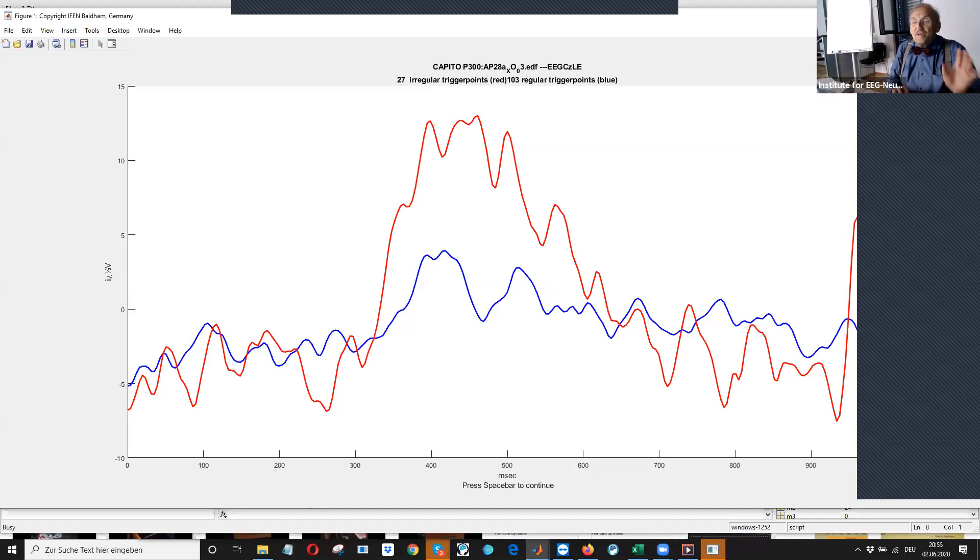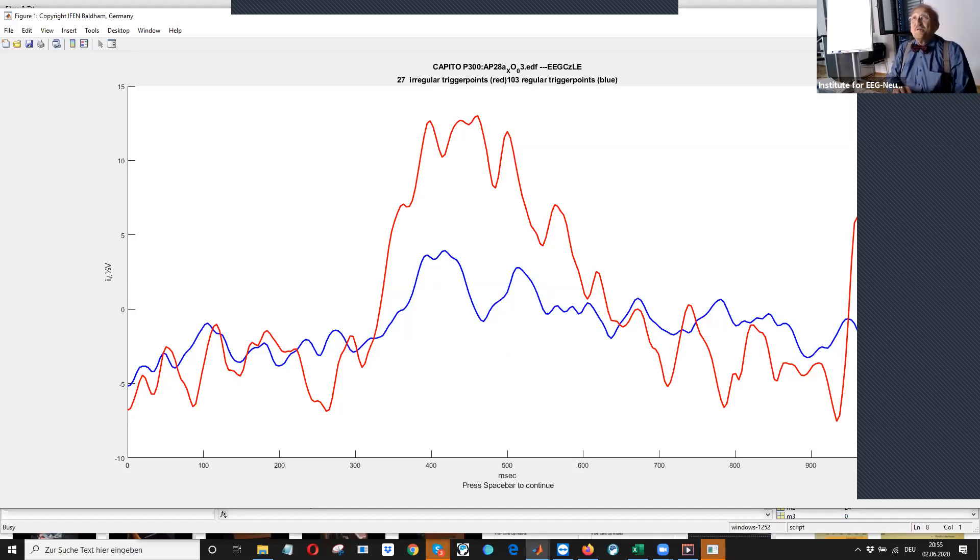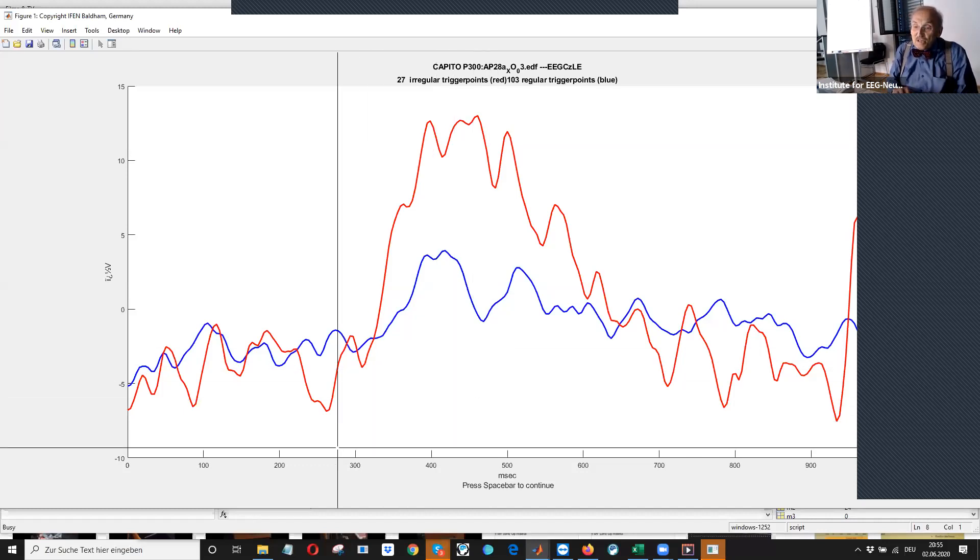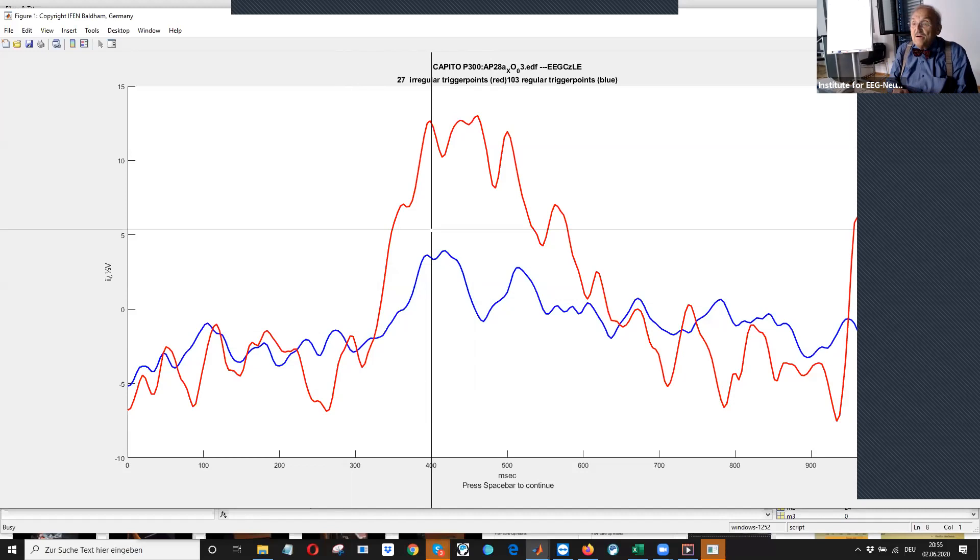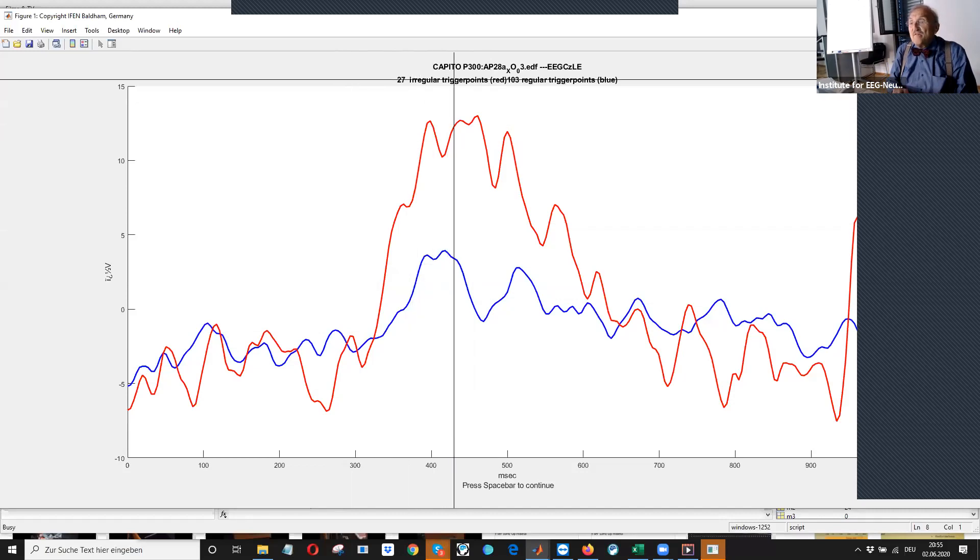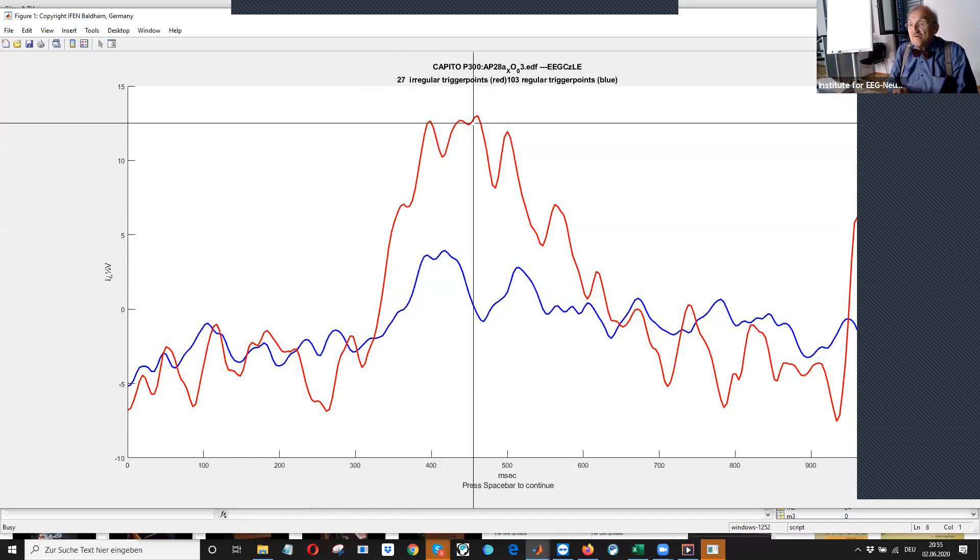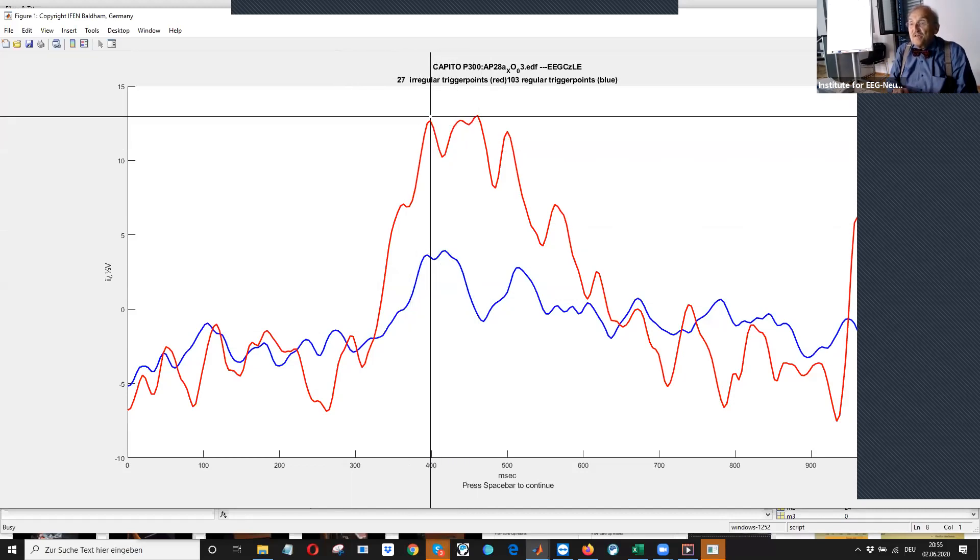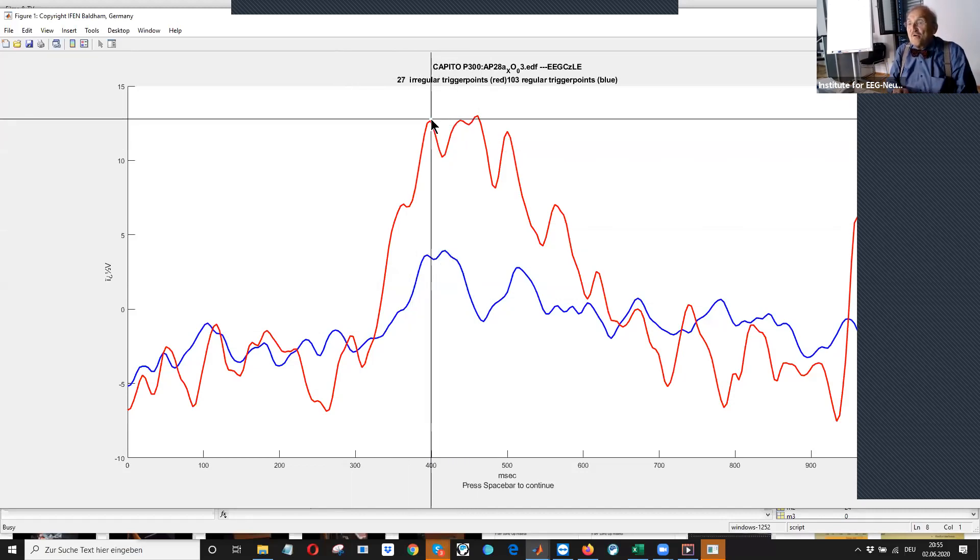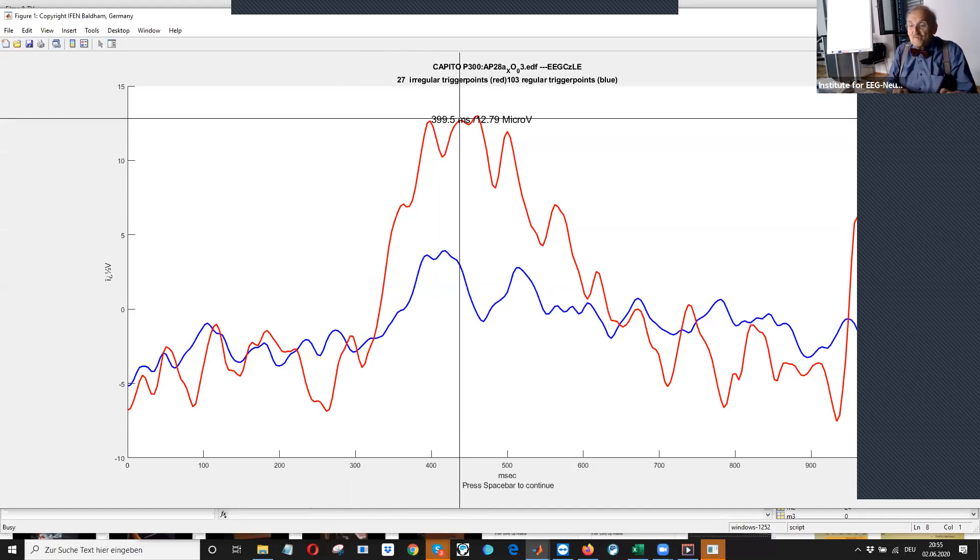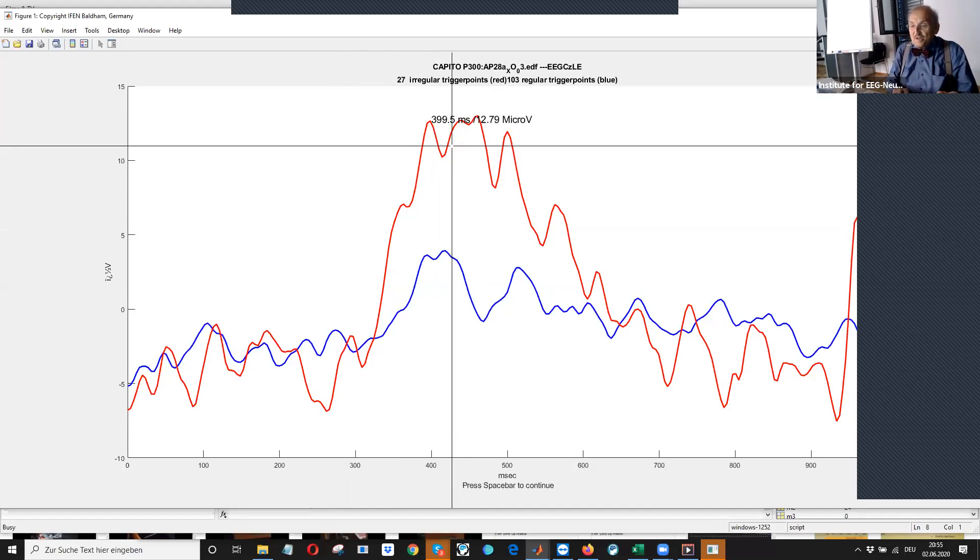If somebody has tried to do evoke potentials with other machines, it's often much more difficult. So it looks similar. So we have here two peaks, but it is almost same, almost close to 400.